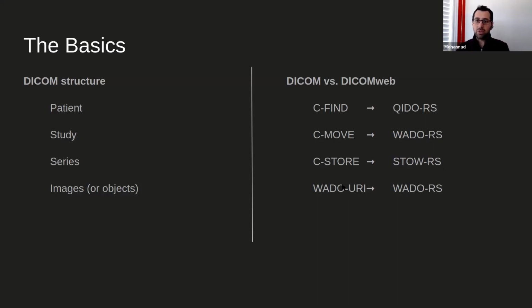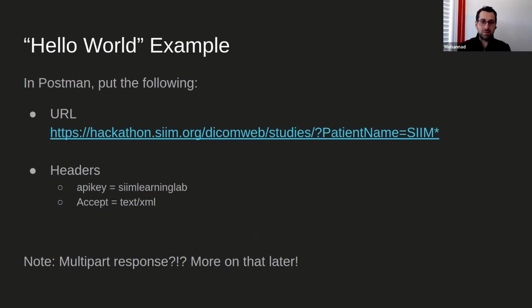And again, what was originally just called WADO and then was retroactively renamed to WADO-URI is now WADO-RS. So don't get confused with the different names of WADO. If you can choose, you'd probably want to choose RS because it's the newest and greatest.